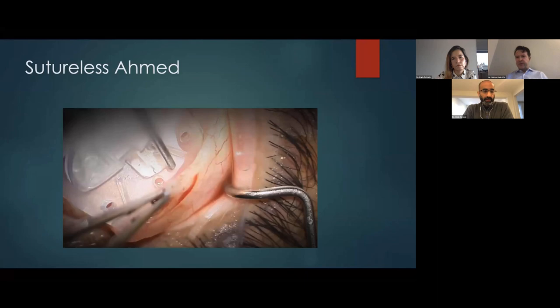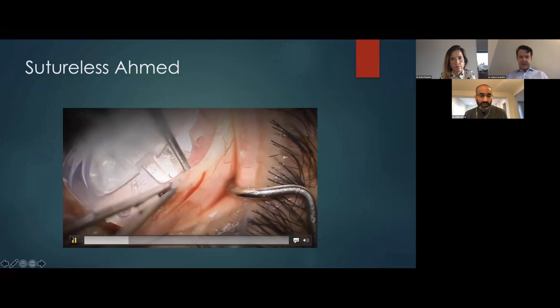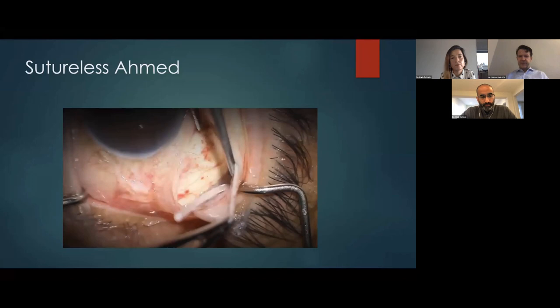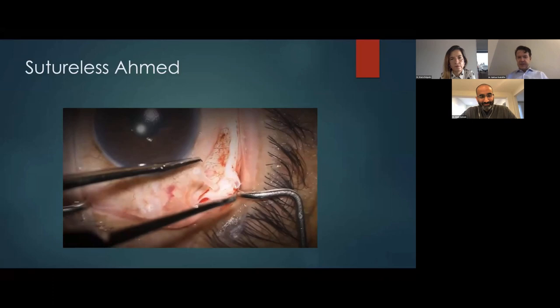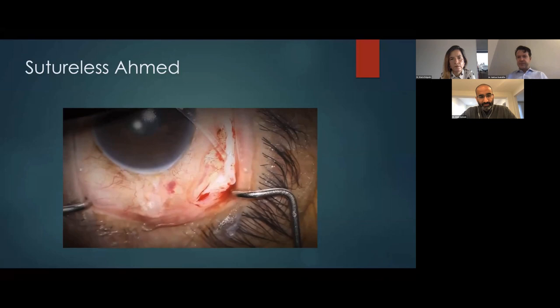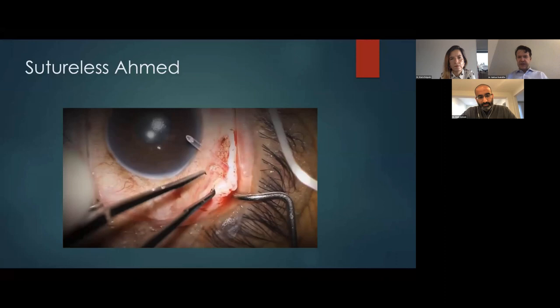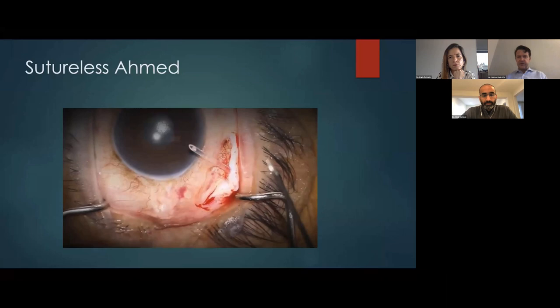Okay. Got it. Yeah. That's a subtlety that I actually never got with your procedure. Yeah, so I'm glad you said it. Fighting this a little bit, I have to wiggle. And then the answer here, how far back I go, is just, I call it deep sixing the tube, but it's gone. And now I'm going to tug to make sure it can't come forward. So that's the orbital rim locking that tube into place. Now I'm going to cut, and I'm going to plan for a little turn. That turn that I just showed you is what's going to help prevent the tube from sliding in and out, because that little turn is actually enough to cut some of those forces down.